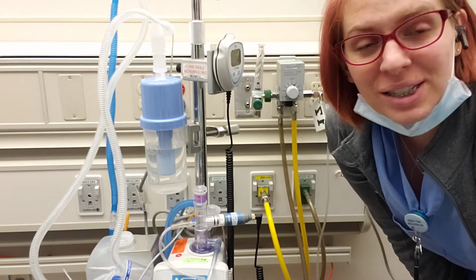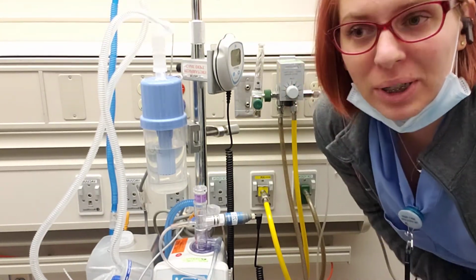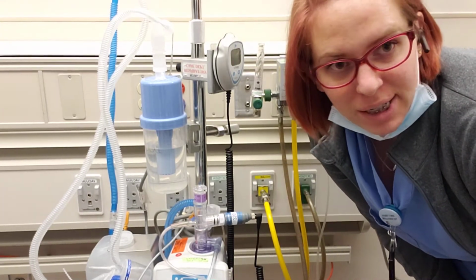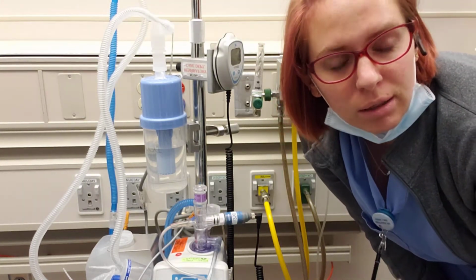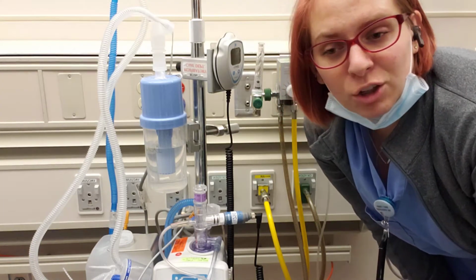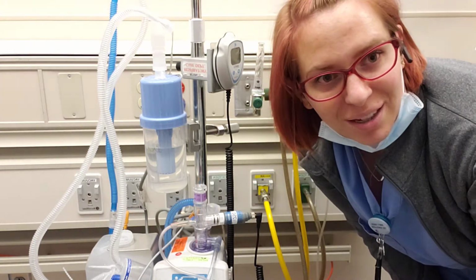This video is to discuss bubble CPAP. Some indications for bubble CPAP would be a newborn that is having severe respiratory distress. This could even be transient tachypnea of the newborn, where they just have excessive fluid in the lungs from delivery that might not have gotten all worked out. It could be for pneumonia and also for recruitment of a smaller neonate.